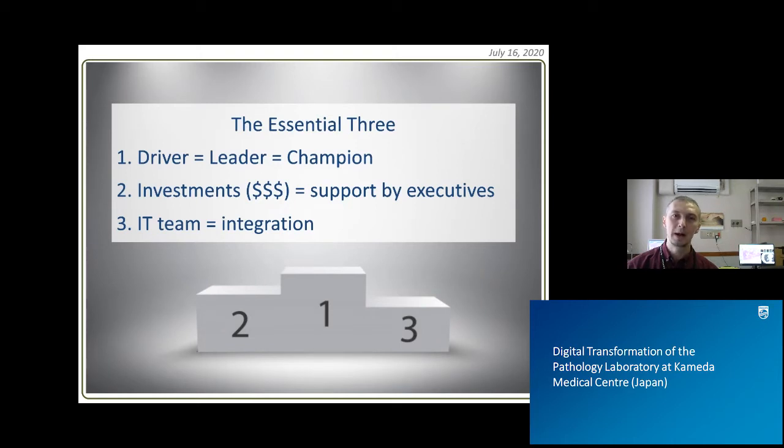Second, you need money, for sure. And for that, you need support from your executives. And number three is also very important. You cannot have success without that. You need to have your own IT team for integration of digital images into the laboratory information system and routine workflow of your pathology laboratory.